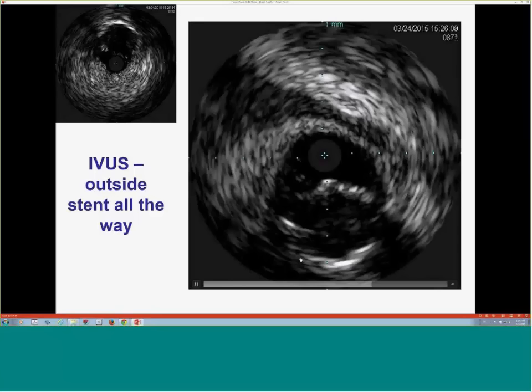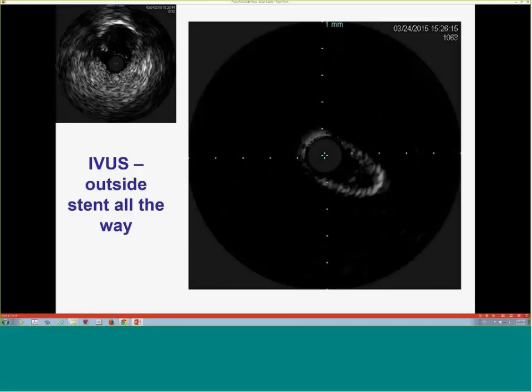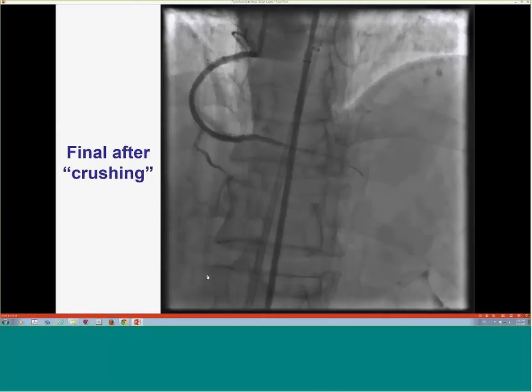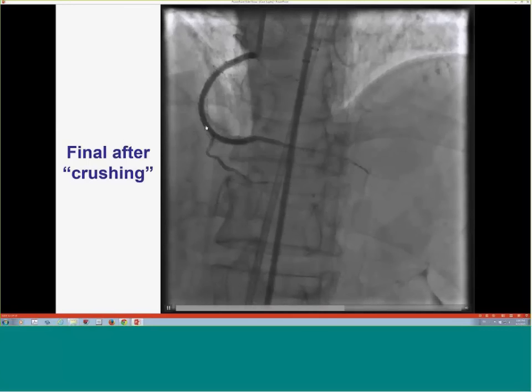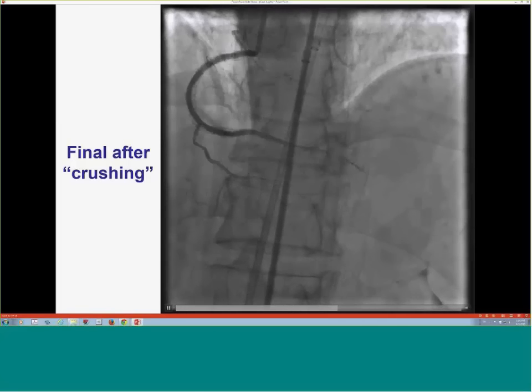So we were a little concerned initially because we thought, well, it's a pretty big stent, and is it safe to do all this subintimal? But the wire was going fairly easily, so we pursued it, and we put a bunch of stents. And it looks a little weird now because you have the old stent in some projections and the new stents kind of overlapping this one. But we did get a nice TIMI-3 distal flow.